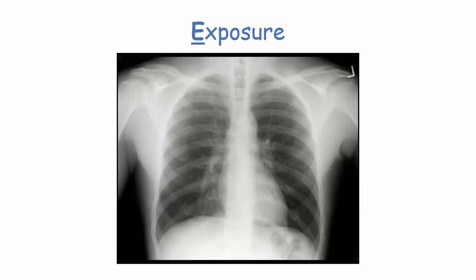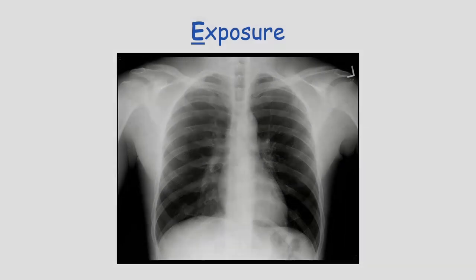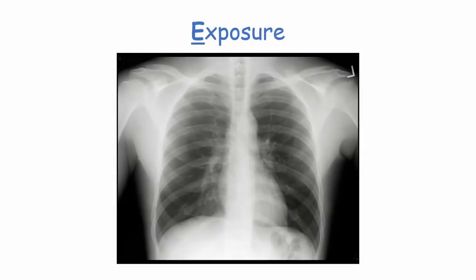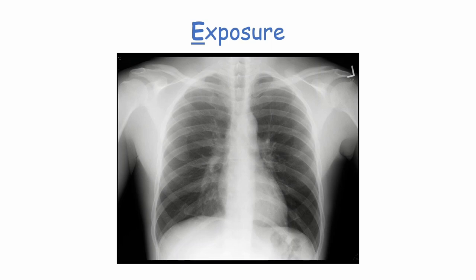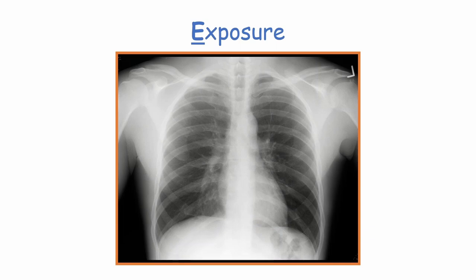Exposure refers to how much X-ray has been allowed to pass through the chest, similar to exposure in a camera. Too much exposure will create an image that's too dark, whilst an underexposed image will be too light. An adequately exposed chest X-ray will have visible vertebrae behind the heart and also a left hemidiaphragm visible up to the edge of the spine. It's also a good idea to check that the whole chest has been exposed — can you see the whole chest from top to bottom, left to right?